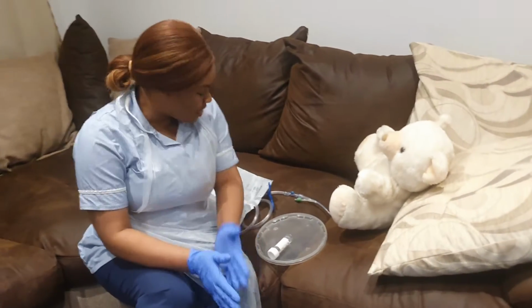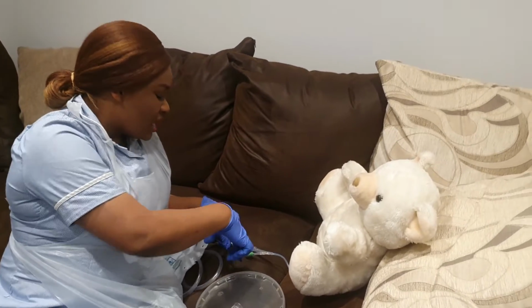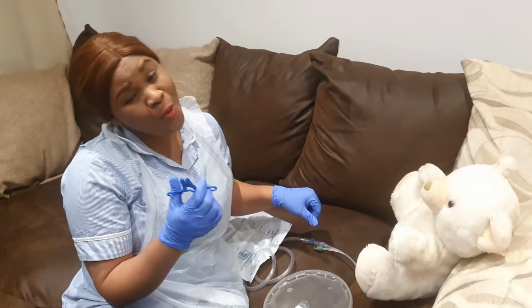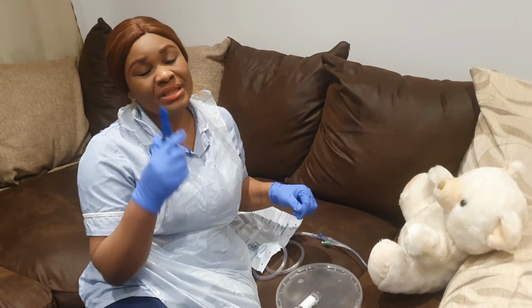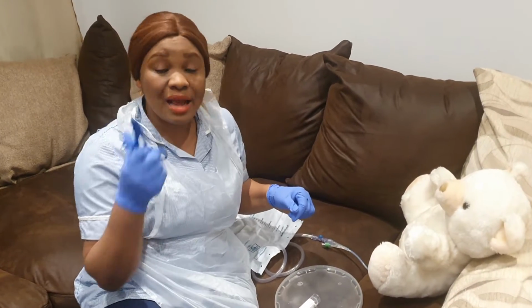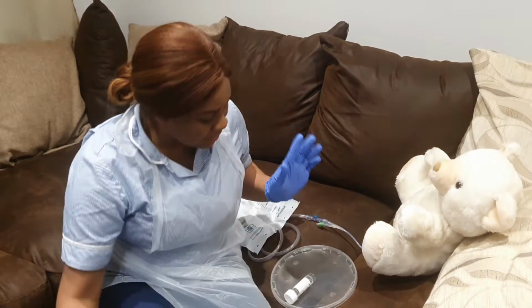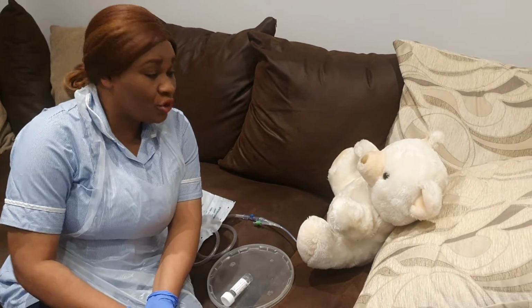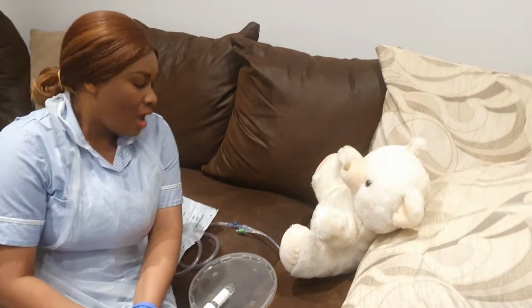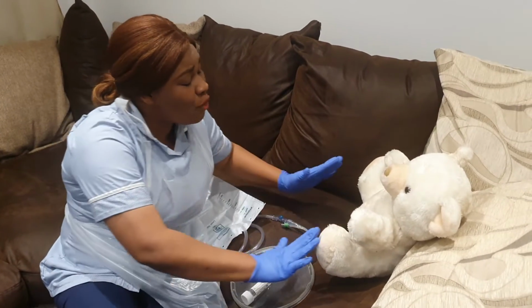What do I need to do? I'm just going to unclamp my catheter. Lovely. So I've unclamped my catheter. And what do I need to do? Because I've unclamped my catheter, then this can go into the clinical waste if you like, or you can just keep this. Thank you so much for your cooperation. I do appreciate this. All right, I'm just going to cover you back now.